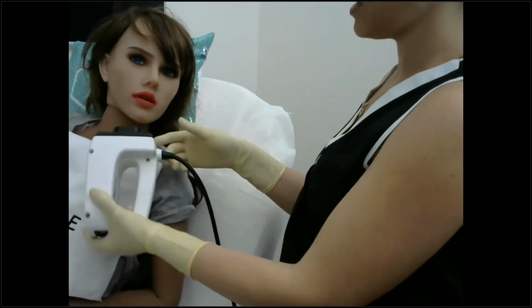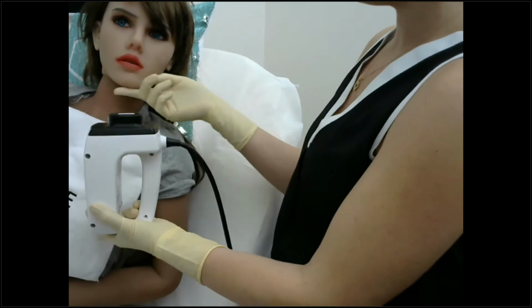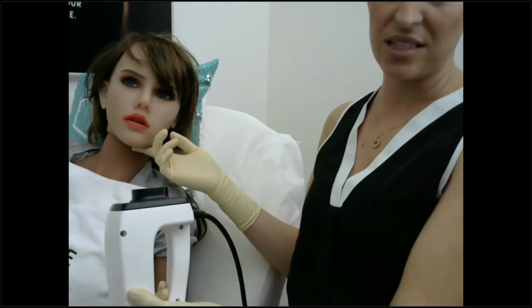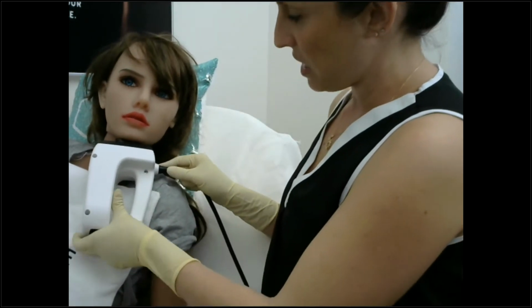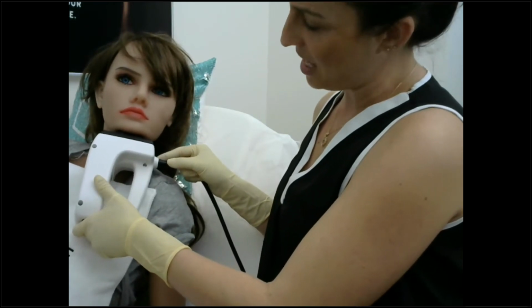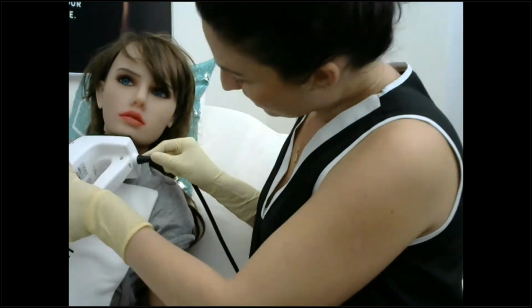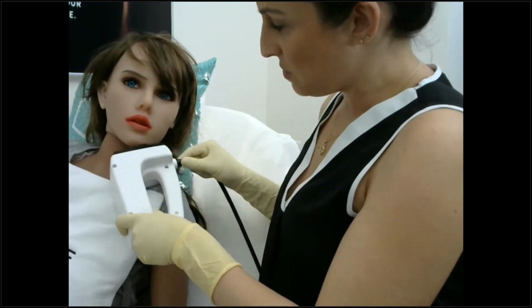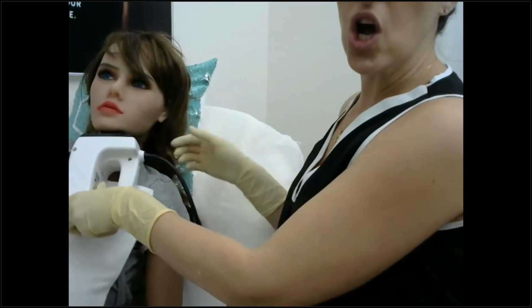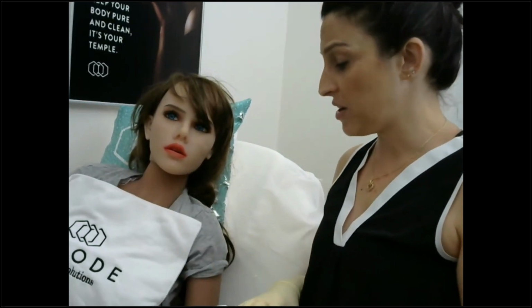Like this. So what I want to do is use gravity. I want to let gravity do its thing, because normally people with double chin would actually show it best when sitting and not lying down. So that's what I want to do, and I press against the skin, and that enables me to work on the tissue that I'm looking to target. So I do that, and I cover the treatment area, and it should be smaller, so it's 2 to 4 times the size of the applicator. How long? Again, we're talking about a minimum of 10 to 15 minutes over the treatment area.